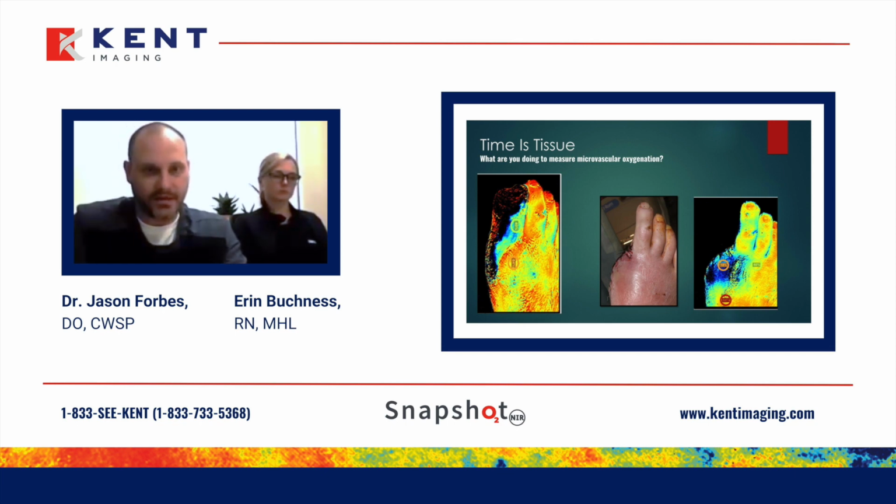Sometimes a podiatrist will just send them over and say, I've done the surgery, go back to you, please get that healed. I'll do a NIRS image right after surgery, and I might get a picture just like this on the right, where you've got really good blood flow except right in that peri-surgical area. If I see him back in a week, that's already going to be bad, but I know now, and I'm going to get the ball rolling and be as aggressive as I can. This patient, I want him urgently in the hyperbaric chamber. If you wait a week, none of that might happen, because that second toe is going to start showing some changes and eventually become gangrenous, and your outcome is going to be totally different in this patient getting the picture now versus 1 week later.